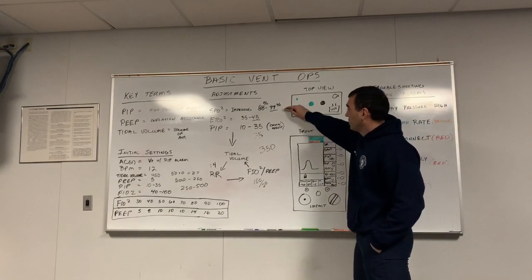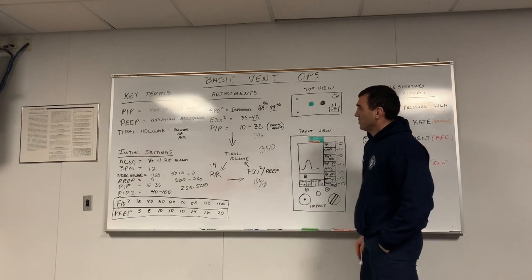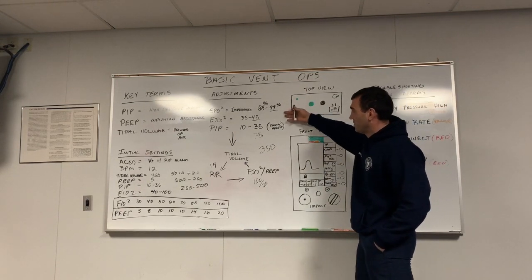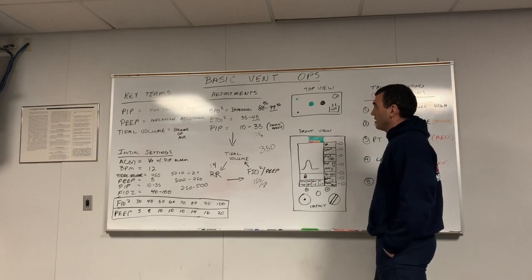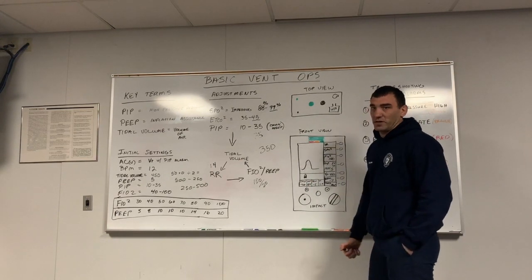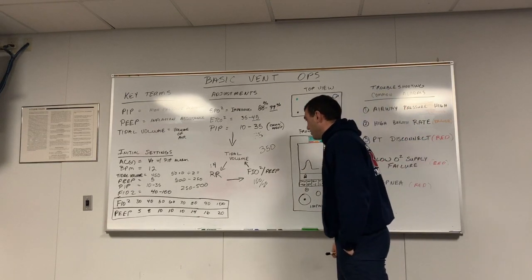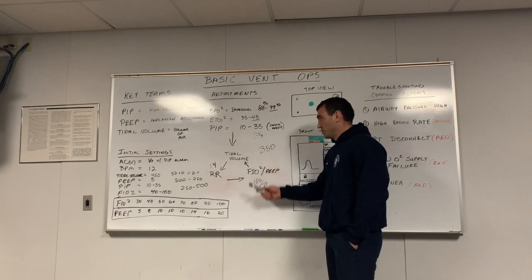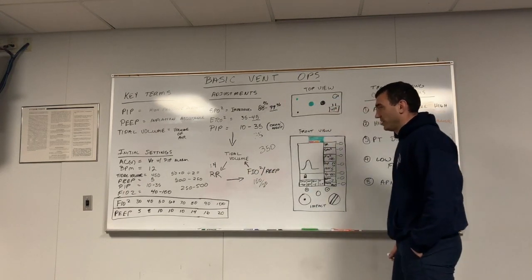All these are patient response to things. These are what I like to call the results of the treatment. This is how I monitor the results. If somebody asks you, how do you know what you're doing is working? These are the measurements that tell me that it's working. That's how I adjust. And remembering that these are proportional and I can adjust these makes it a lot easier.